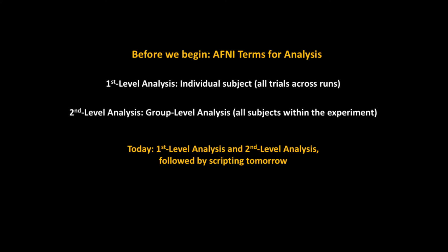With AFNI compared to something like FSL, first level analysis means we're analyzing the entire individual subject. So across all the runs, all the trials, that's all going to go into a single design matrix. In something like FSL, you analyze each run separately, and you analyze the variance in each run separately. That's just their approach. They try to use it to form a more accurate parameter estimate.